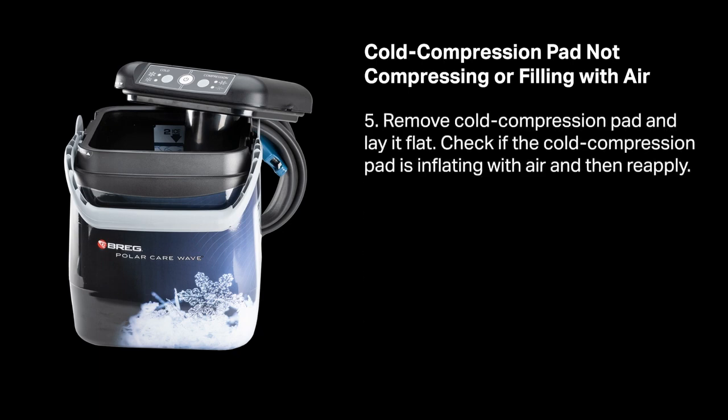Remove the cold compression pad and lay it flat. Check that the cold compression pad is inflating with air, and then reapply.